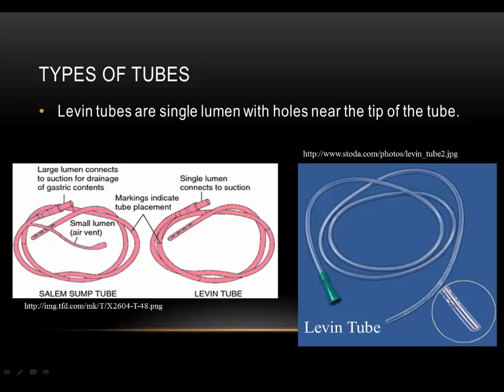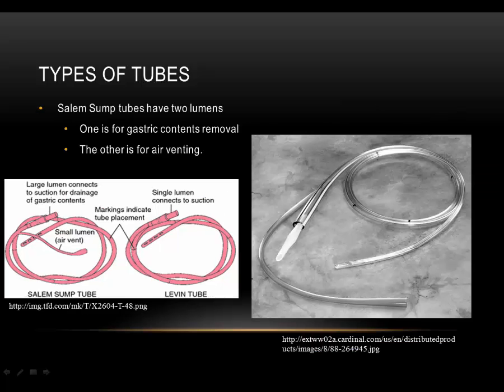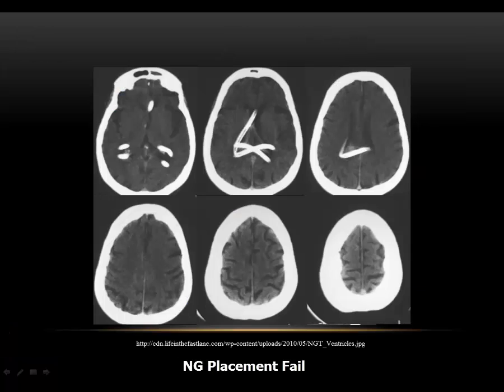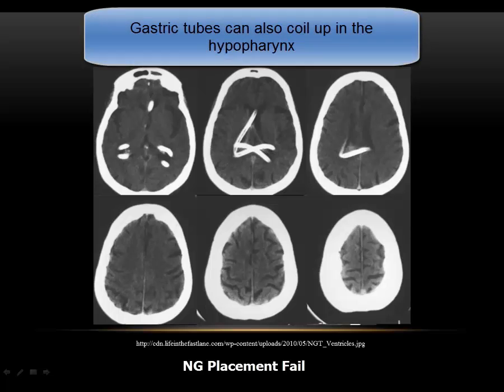There are several types of gastric tubes. Here is the single lumen Levin tube. Here is a dual lumen Salem sump tube. Dual lumen nasogastric tubes are designed to suction fluid and air from the stomach without damaging the gastric mucosa. Most tubes have a valve placed on the end to protect from gastric contents. Here we have the Lopez enteral valve and the Prevent anti-reflux filter. Finally, we have x-rays of a poorly placed nasogastric tube that ended up in the lateral ventricle of the brain.